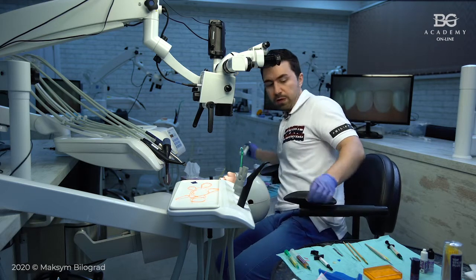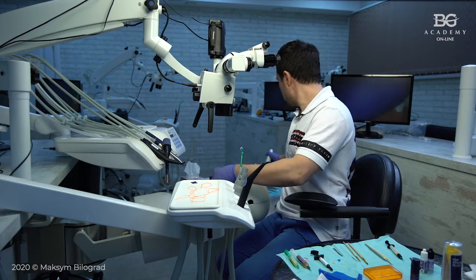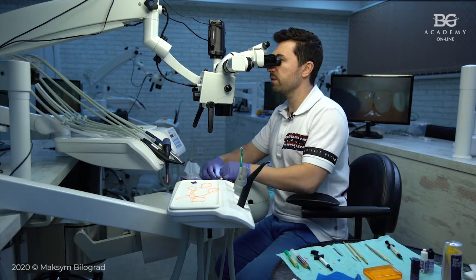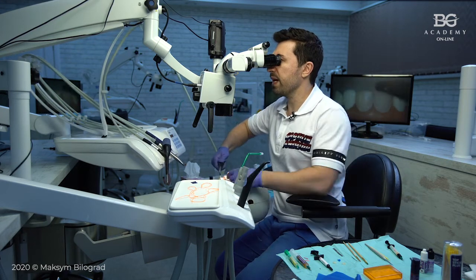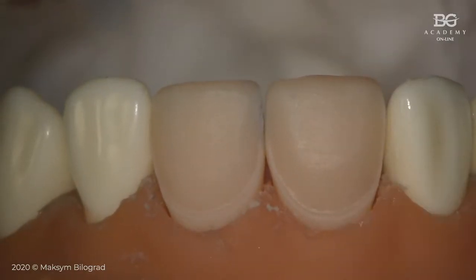Let me just remove this excess of the colors on the teeth with ethanol, because they will not be good during the process of cementation here. Okay, so if everything is fine and you made the adjustment of interproximal contacts, you can prepare the ceramic for bonding.